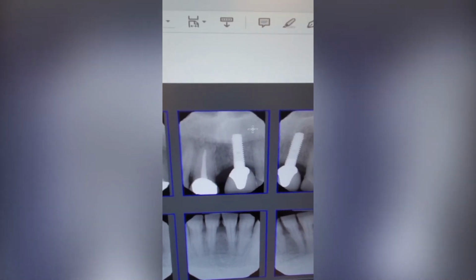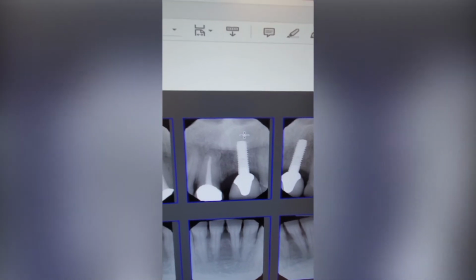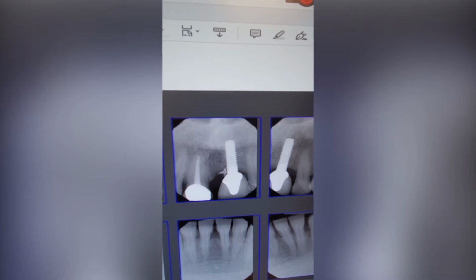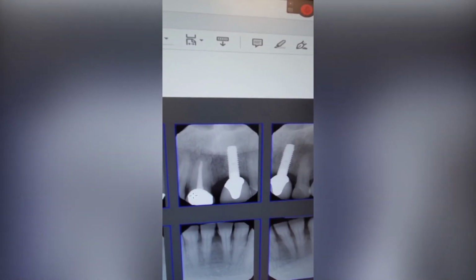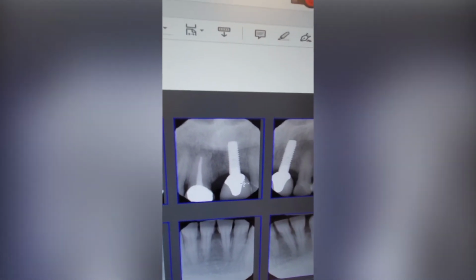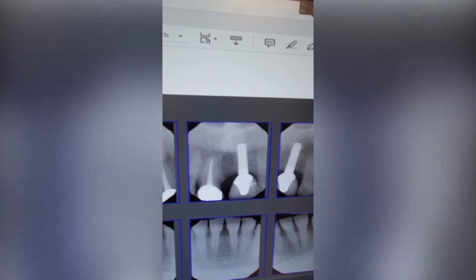This created a gap up in this area, and the gap was filled with a bone grafting material called AUGMA. This needs to be held in place for about 8 weeks, and then everything will be removed and a new restoration can be placed on this implant, giving us a much more aesthetic and normal crown height that matches the left and the right crown. The central incisors will have the same position of the free gingival margins, making them more aesthetic. All right, let's check out this surgical procedure.